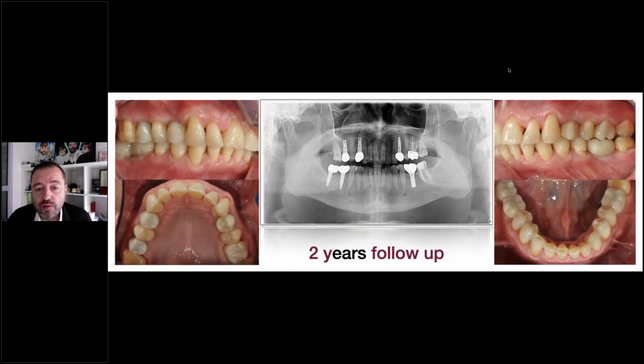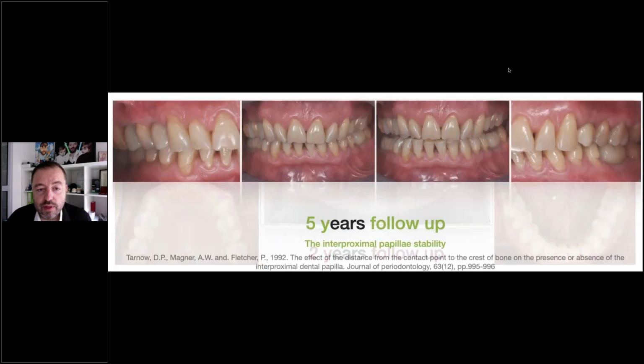As you can see, we had full zirconia crowns that were cemented directly on the tissue level implants. At that time, there were not so many alternatives in terms of colors, so you can easily identify the full zirconia crowns that were done 7 years ago. But as you can see, there is no gap, no micro gap between the connection, the crown and the implant shoulder. And again, 5 years follow-up, and you can see how the papillae are present there.